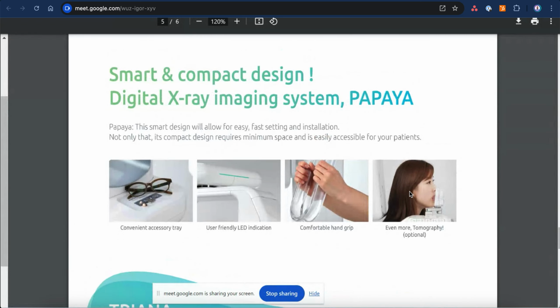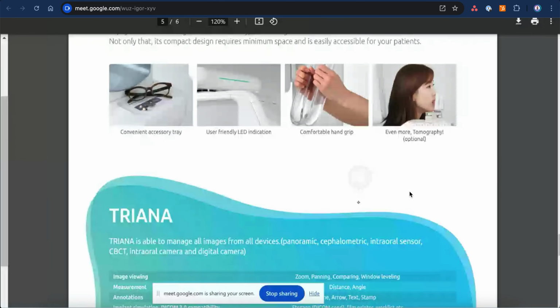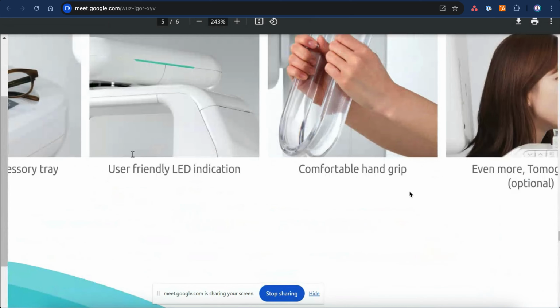Okay, so this is how the patient is inserted. Now for example, when I have you take the x-ray, you can put your personal belongings here in the convenient accessory tray. Of course, anything metal is prohibited in x-ray because it causes something called x-ray artifacts, like a source of noise and white radiation that can appear on the x-ray. So all things metal and all belongings must be put aside.